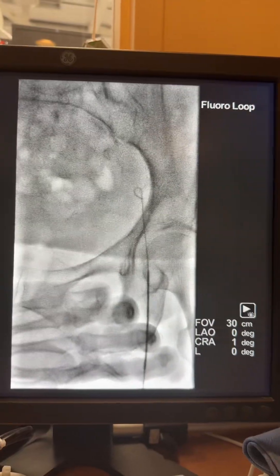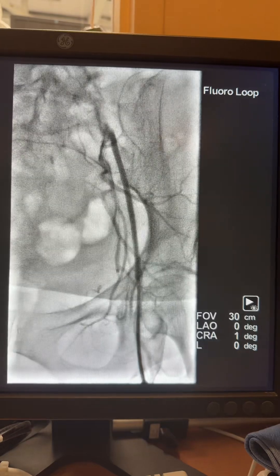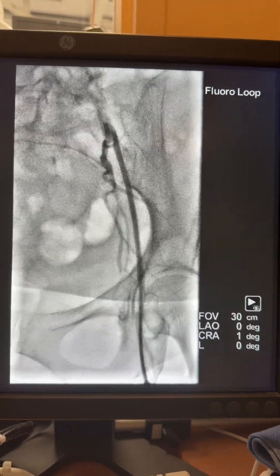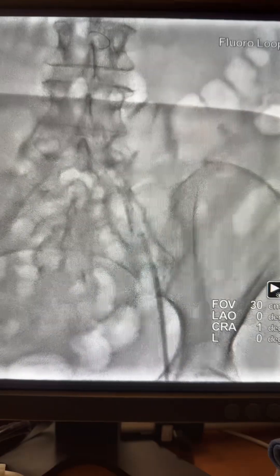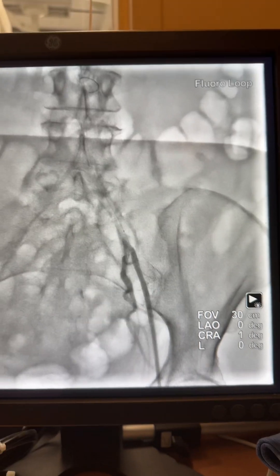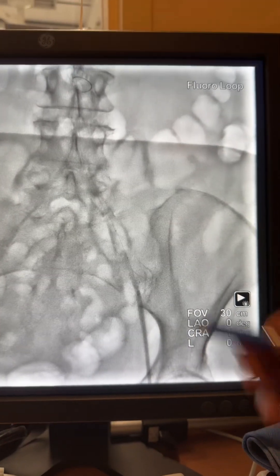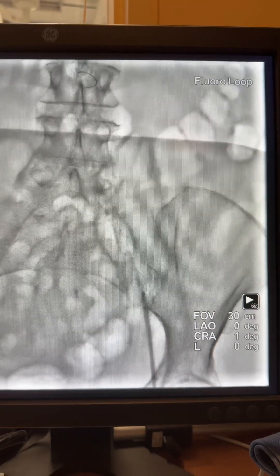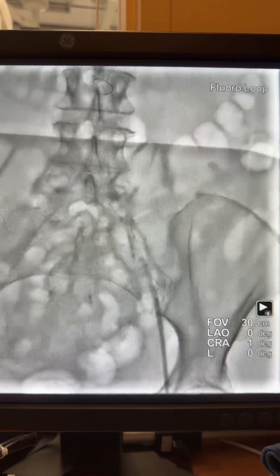Here is the access from the left femoral. As you see, the wire stopped in the iliac, so the sheath was advanced and angiogram obtained — and you can see the iliac is completely occluded. The next step, as always if you've seen my older cases, I always use Run-Through wire, as I have better luck with this wire.